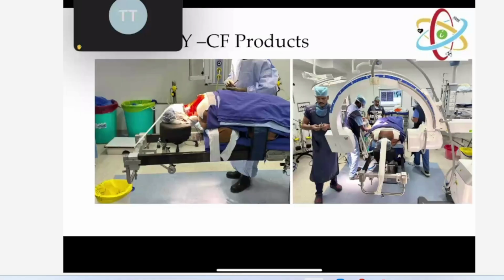Third, you are not doing one more revision surgery, or you are not being a failed surgeon or having a failed surgery. And finally, the patient's burden of one more surgery is reduced. It's almost a life-saving thing which is easily doable just using carbon fiber products made from the waste material which they would otherwise throw away.